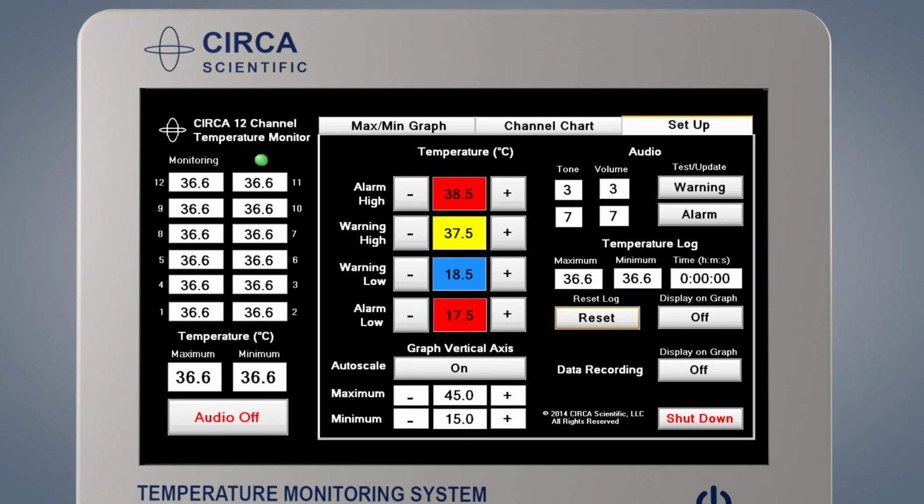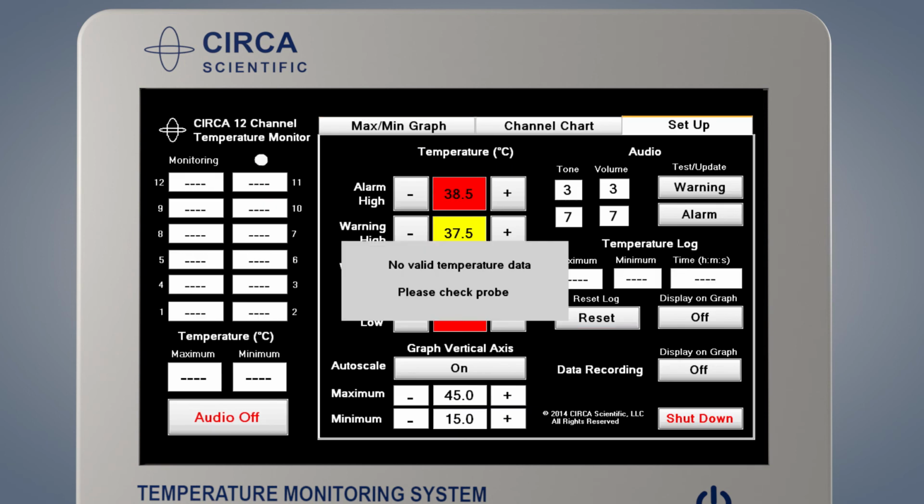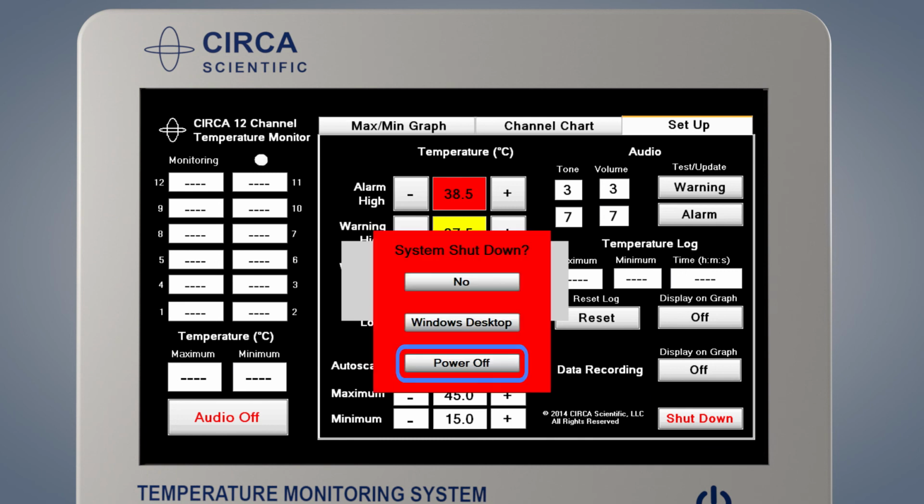At the end of the procedure, disconnect the interconnect cable from the probe and slowly remove the CIRCA probe. The CIRCA monitor is now ready to be shut down. Press Shut Down. Press the Power Off button on the pop-up screen that appears, and the monitor will shut down.